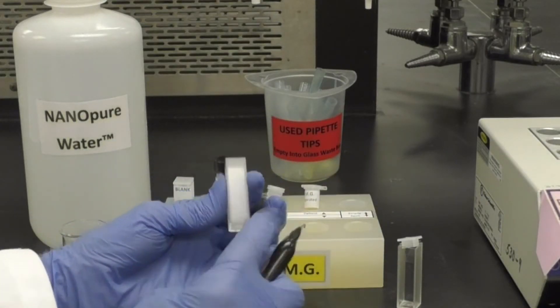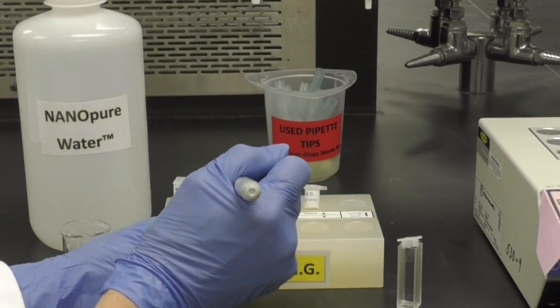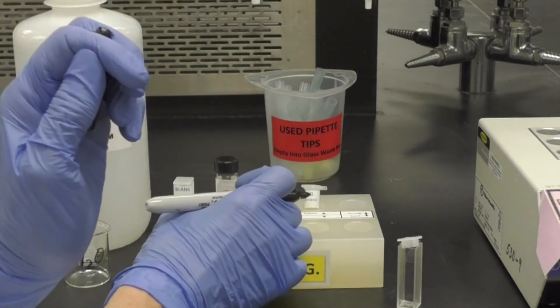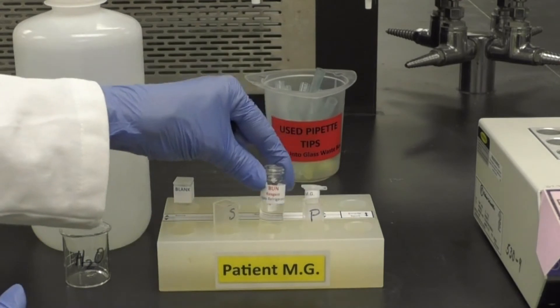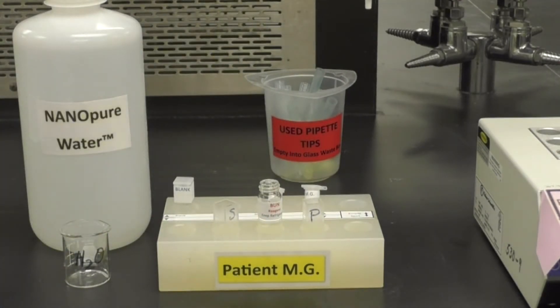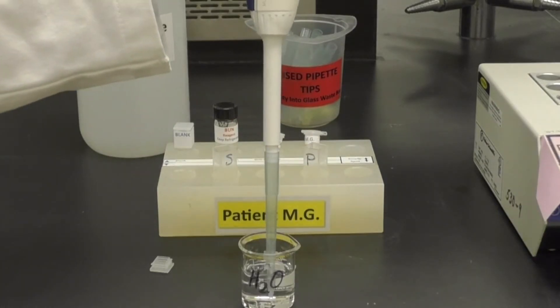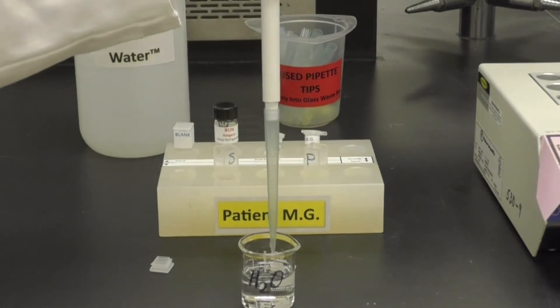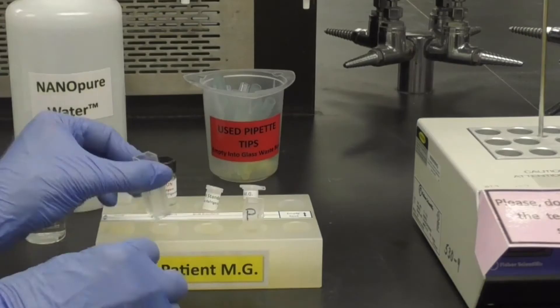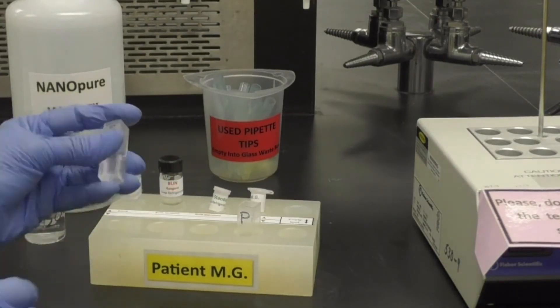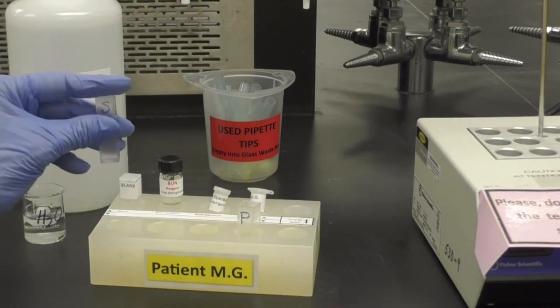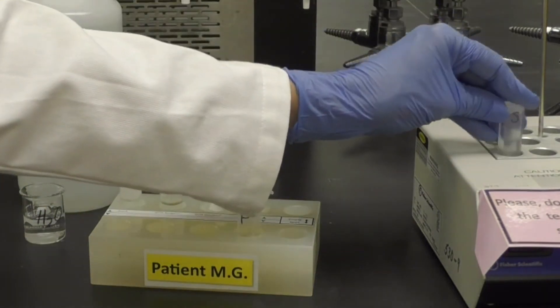Start by labeling the two cuvettes. Here we are using S to indicate the standard and P for patient. Next, pipet 1 milliliter, in other words 1,000 microliters, of the BUN reagent into each cuvette. Then add 1 milliliter of Nanopure water to each cuvette. Cap the standard cuvette, rotate to mix, and place it in the dry bath to warm for 5 minutes.